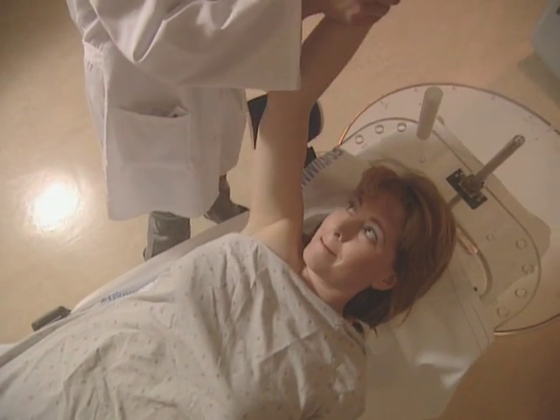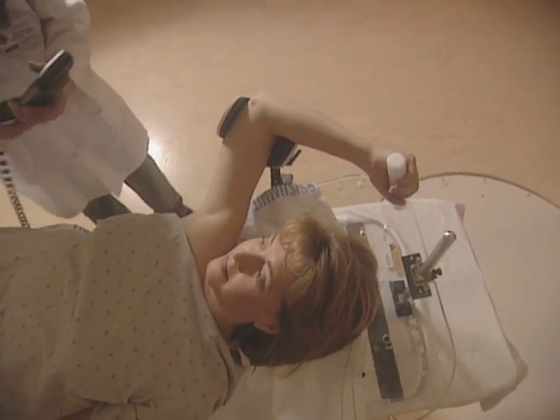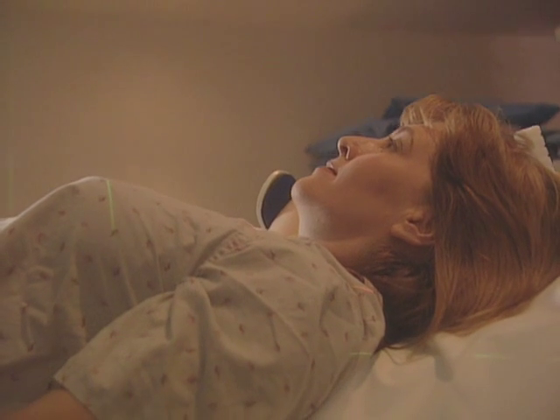If this technique is used, you will lie in a semi-reclined position with your arms above your head. The linear accelerator will then deliver the radiation from four or more directions, focusing a high dose of radiation on the lumpectomy cavity. These treatments are safe and painless.